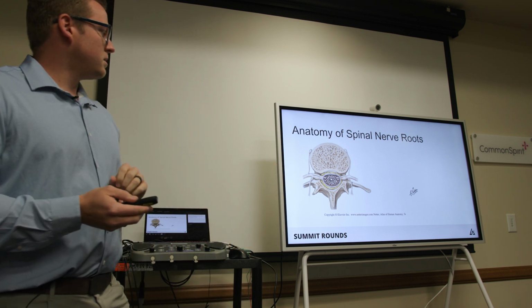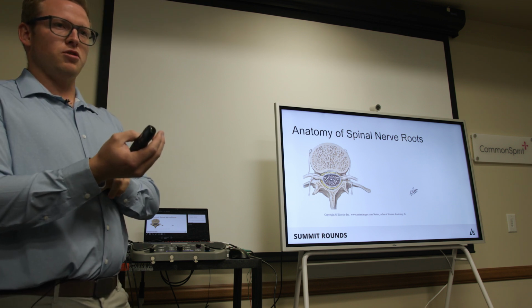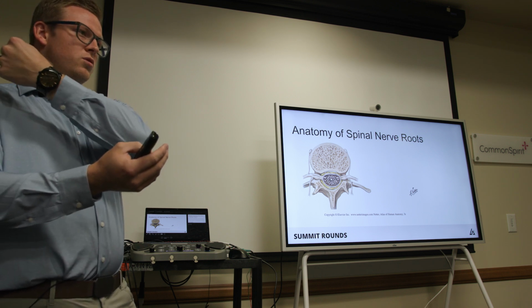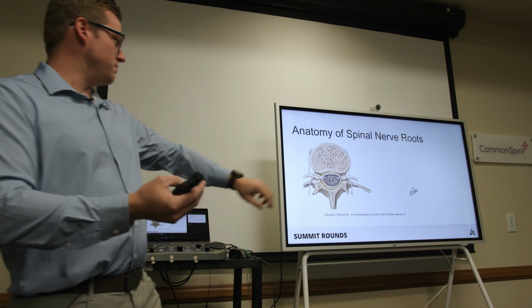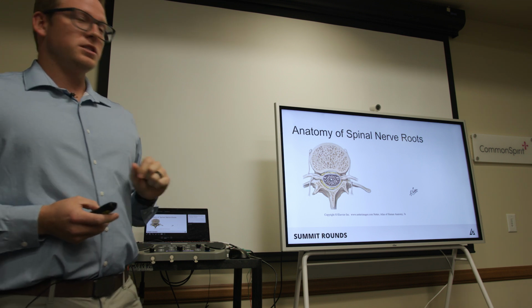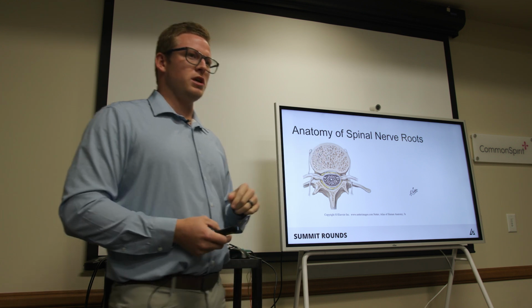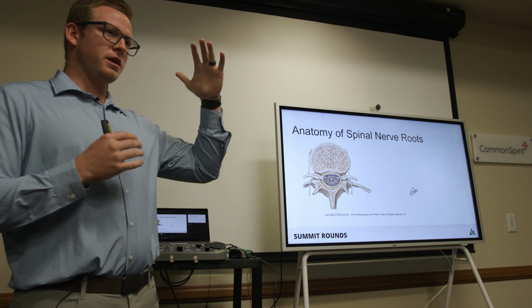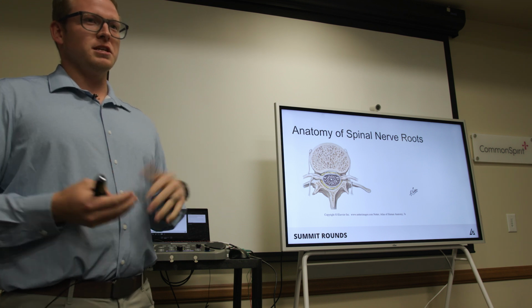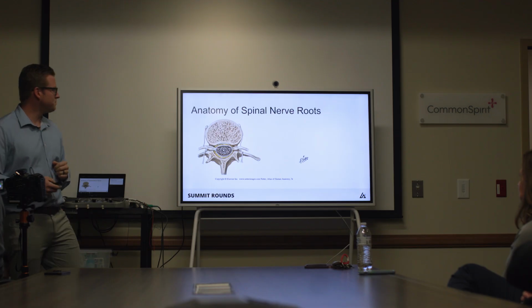So when we test motor and sensory nerve fibers down in the leg, we demonstrated on Brandy's arm. And so when I was checking those sensory nerves, those are not the same sensory nerves that end up in the spinal cord, because it's going to synapse with that second one in the dorsal root ganglion close to the spinal cord here, and then continue in. And so the sensory nerves that we're testing are not the ones that would be affected by a radiculopathy happening right here. And so a characteristic pattern when we're doing EMGs of a radiculopathy, you might have diminishing of the motor responses, but the sensories would be spared because the sensory nerve that you're testing is not the one affected by a disc herniation or whatever is causing that nerve root impingement.